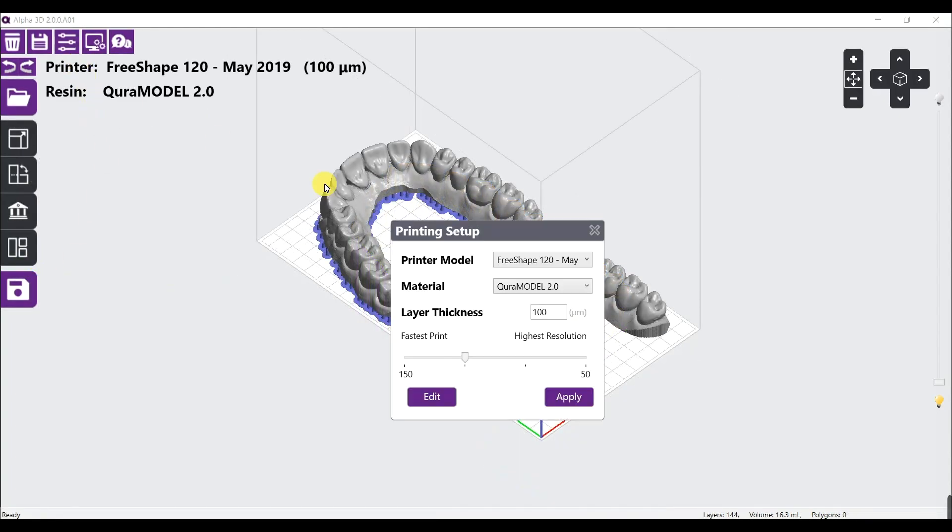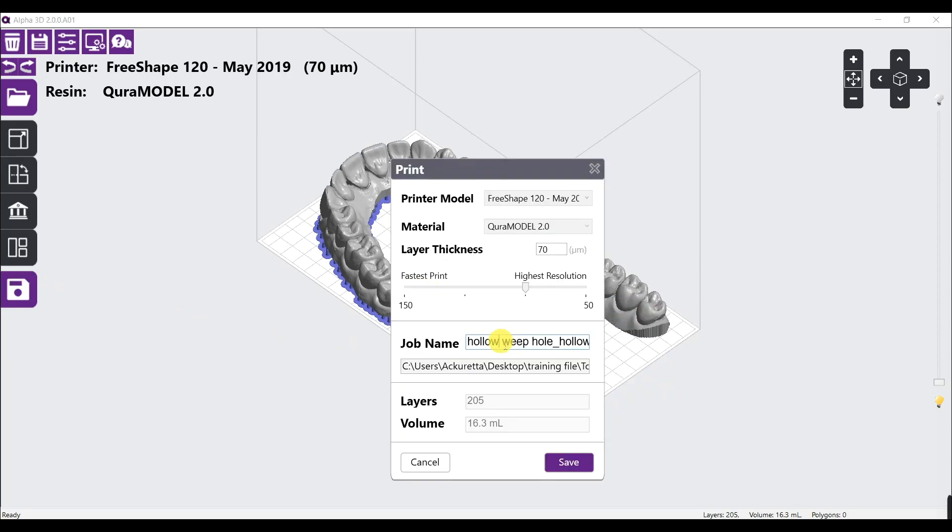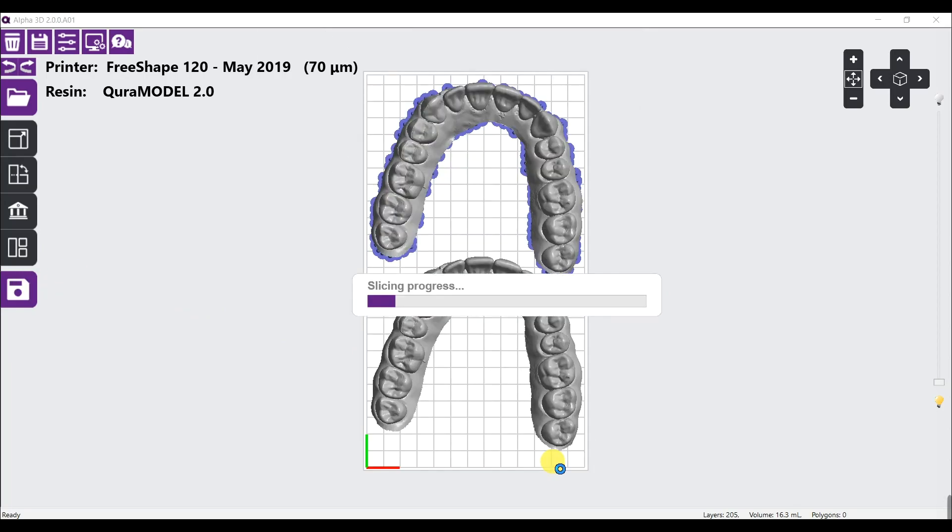Double check everything, and then we can just slice the file. The slicing process might take a minute or two. While waiting, let's go set up the printer.